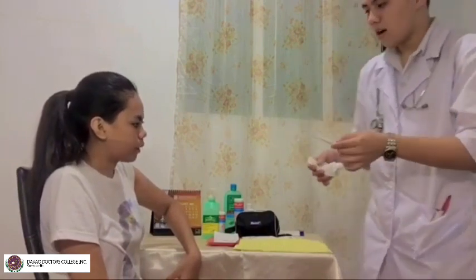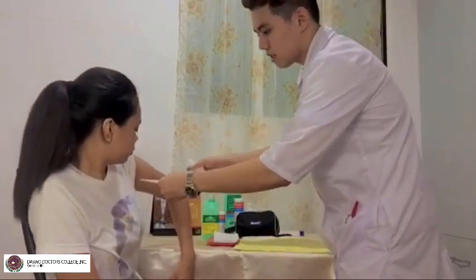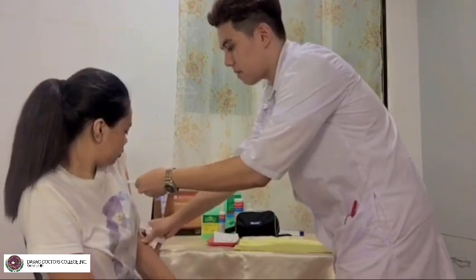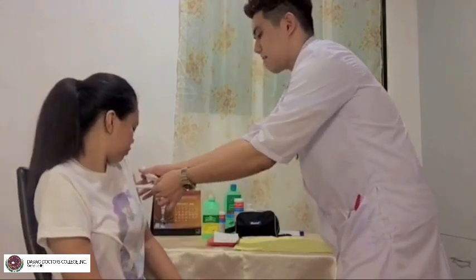So, now, ibutang na nako ma'am ha. Okay. Pakitaas lang ko ma'am. O sige. Okay lang ka ma'am no? O sige, i-wait lang nato ni siya ma'am ha.